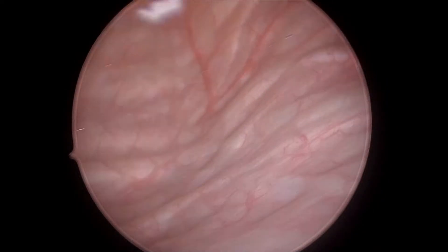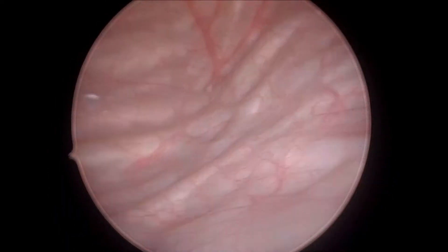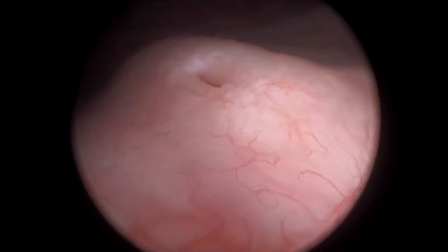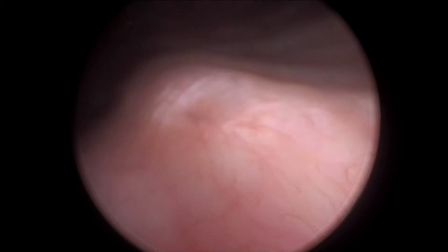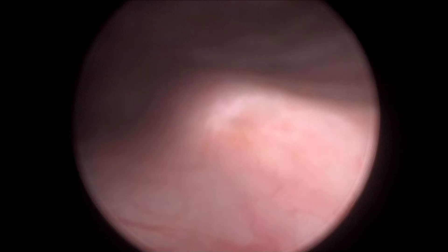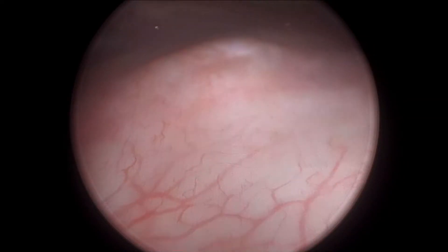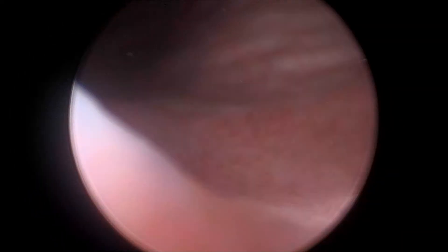This is the anterior wall of the bladder and this is the posterior wall of the bladder. Since this is a female patient, below will be the uterus, so that is the bulge you are seeing here. The inter-ureteric ridge forms with the trigone there. Peristalsis can be easily seen with urine coming out. Post-hysterectomy cystoscopy is also a good thing to perform routinely to find out any ureteric injury.